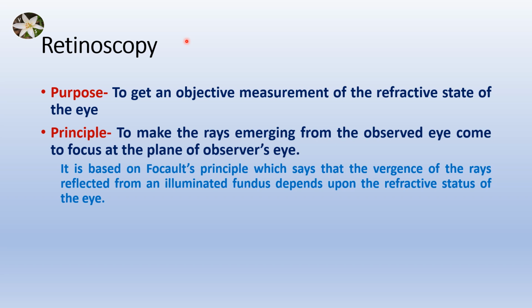While with the autorefractometer, most of the task is done by the machine automatically, the retinoscopy has to be done manually and it requires more skill. So we need to study the procedure and understand it.